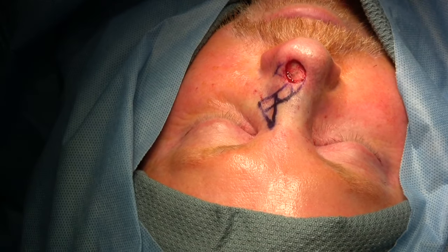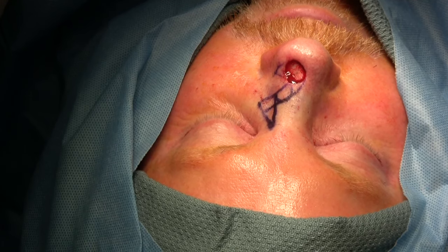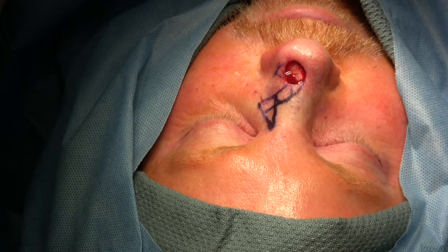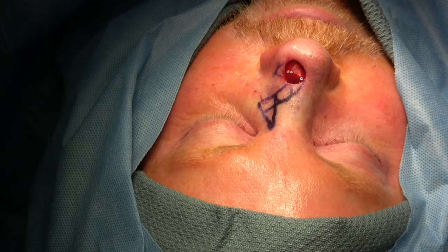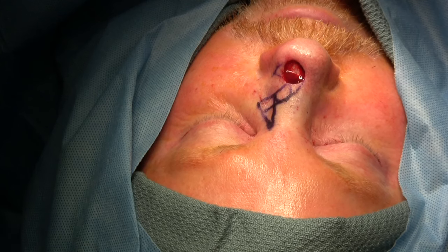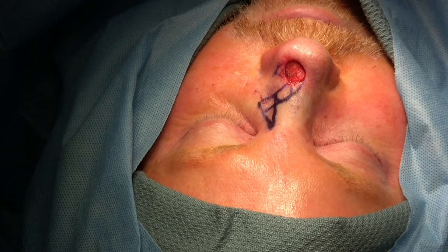At this point, we have received our frozen section results, and the margins are clear. There was still residual basal cell carcinoma in the center of the defect, but the margins on the surrounding boundary and underneath are all negative. We can safely elevate our flap and inset it at this time.